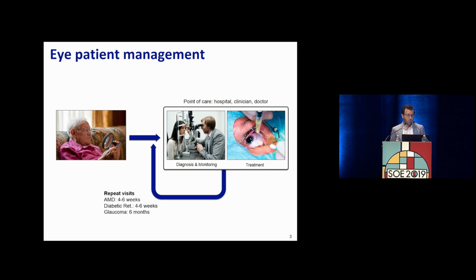It's a management problem more than anything else. This is especially so for AMD and diabetics, but also for glaucoma. So this ensures, in a way, a data pipeline that is recurrent, happening over months, if not years.